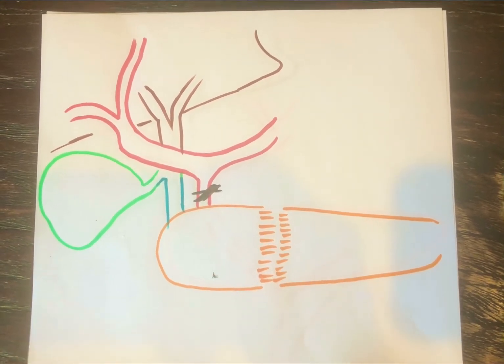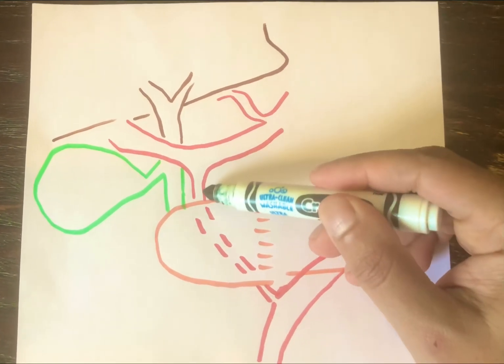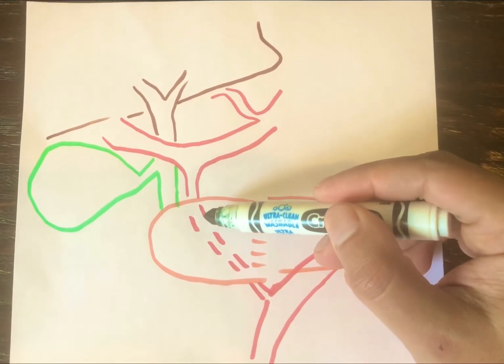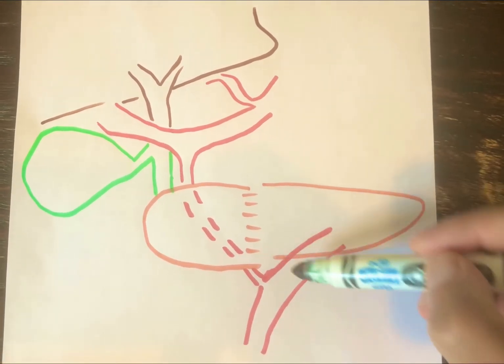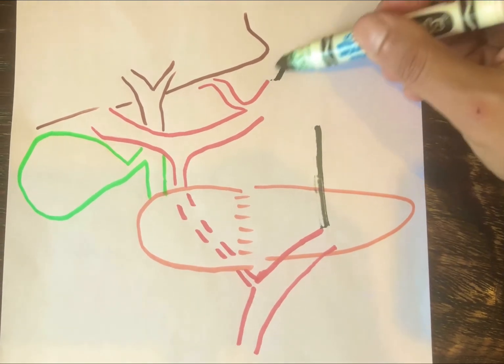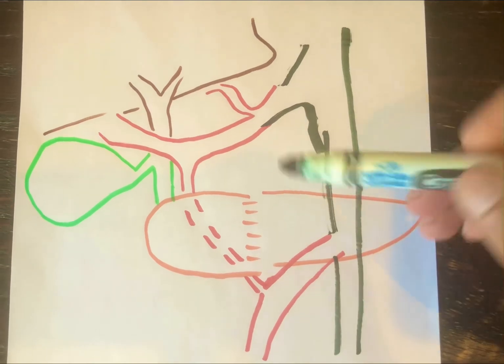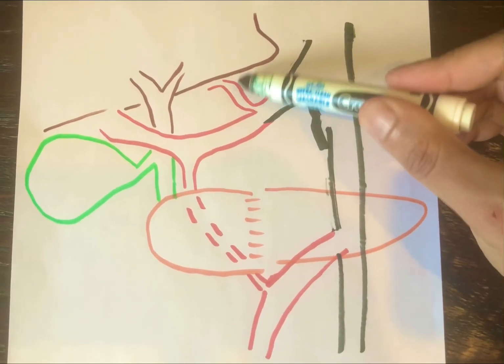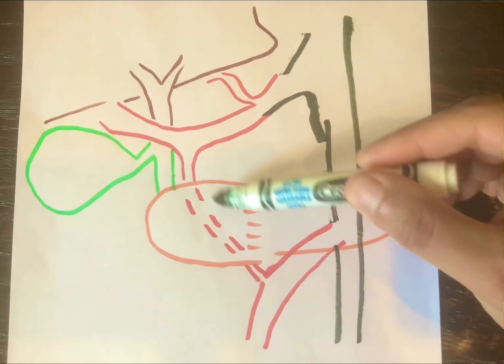Now, one important aspect of this care is that sometimes what you thought was the GDA is actually, if you track it all the way down, it is going behind the pancreas and is coming off the SMA, and this is what the celiac axis is here and this is what the aorta is. So basically, this is the replaced left and this was the replaced right and this is the replaced artery behind the pancreas.